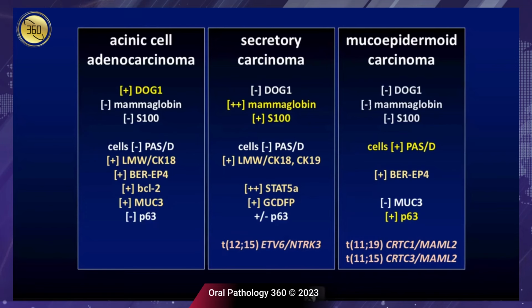So a few immunohistochemical stains like DOG1, S100, and PAS diastase, and interestingly enough, strong overall positivity in most of the cells, will help you tease out a mucoepidermoid carcinoma, as opposed to this combination of P63 and P40 that lends itself more to polymorphous adenocarcinomas. And we're fortunate now to know that there are two genetic tests we can do on these. If we have an NTRK mutation, that will lead us to a secretory carcinoma diagnosis. And if we have the CRTC mutations, those will lead us to a mucoepidermoid carcinoma.